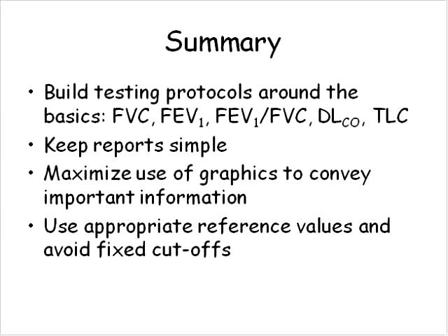We do some trach patients in our lab, and we really tailor each one of those tests to the specific clinical question that's being asked. So if the physician who refers the patient wants to know what the patient's FEV1 is, then we tell them right up front, if you want us to measure the FEV1 through the patient's tracheostomy tube, you're probably going to get a number that's not really very meaningful. However, if the patient can remove the tracheostomy tube and exhale forcefully through the stoma, then you may get a number that may represent something that resembles a real FEV1.